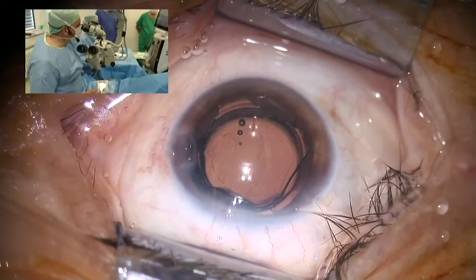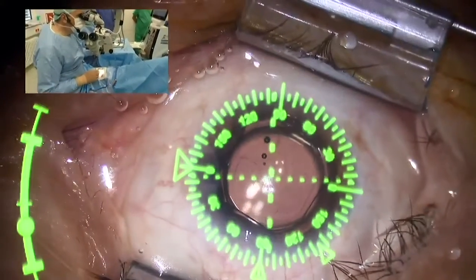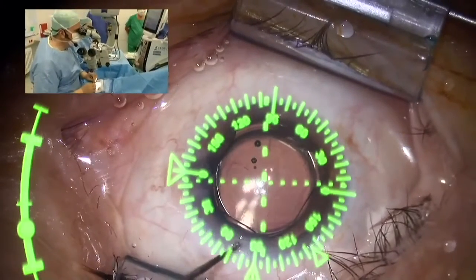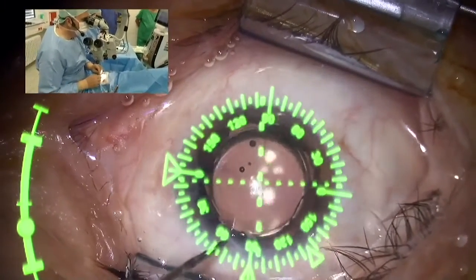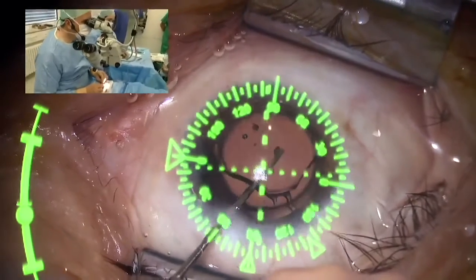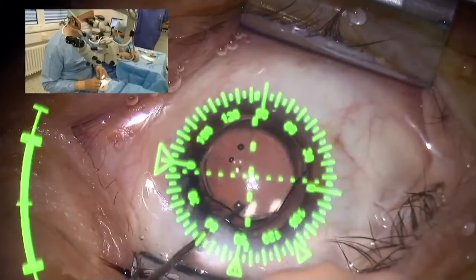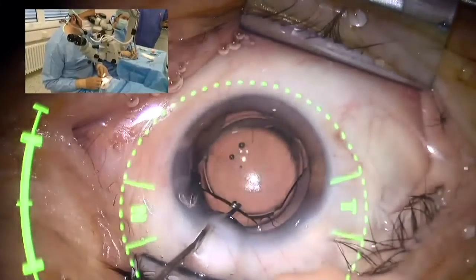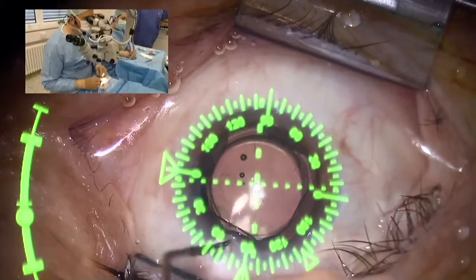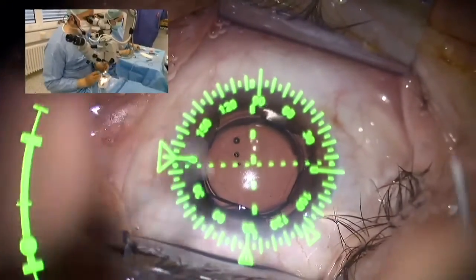Now we have to check that the implantation of the add-on didn't interfere with the axis of the underlying toric IOL, which is hardly the case. Now I'm satisfied. There will be a final check. Probably I will rotate the lens as well.